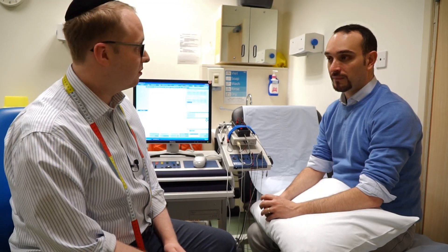The commonest reason to have nerve conduction tests is to assess carpal tunnel syndrome. There are plenty of patients who are worried about what these tests entail, and so this video is going to show you just how simple and relatively painless, hopefully, nerve conduction tests should be.